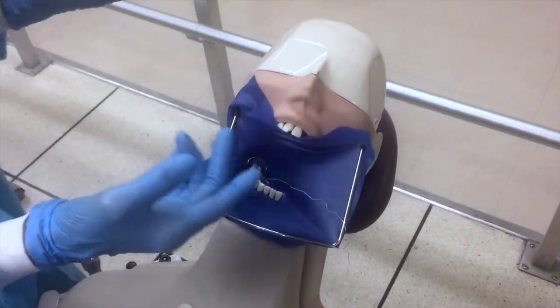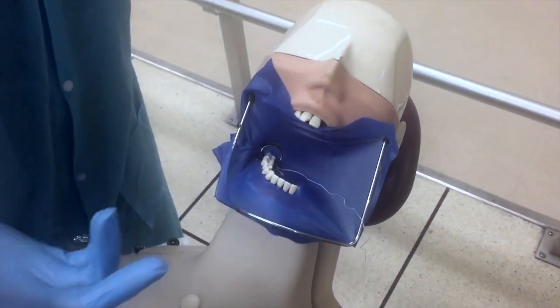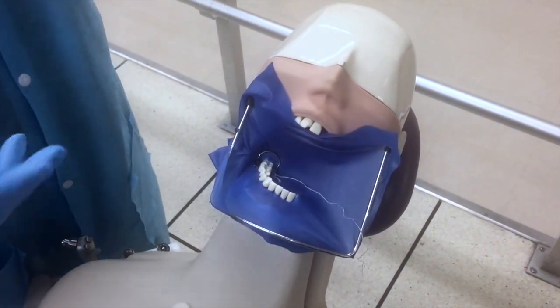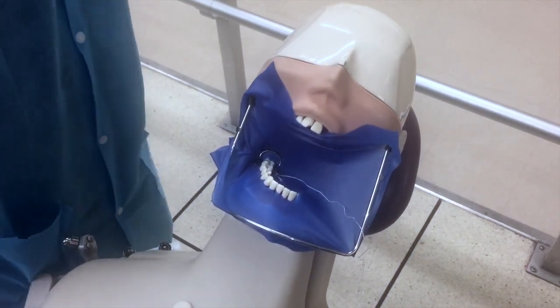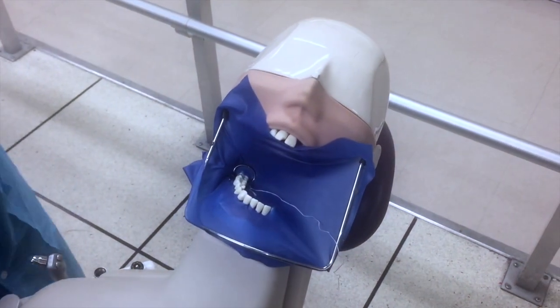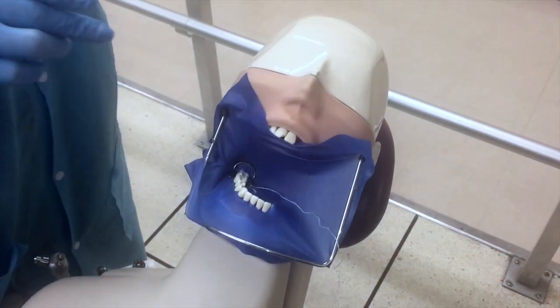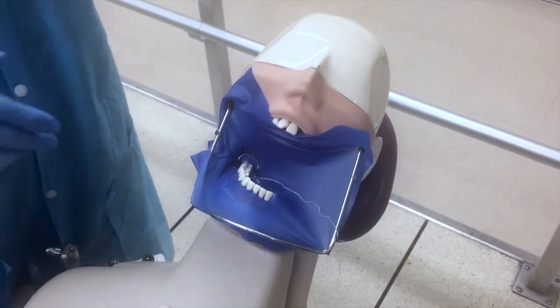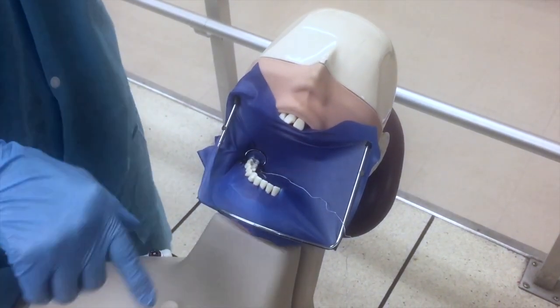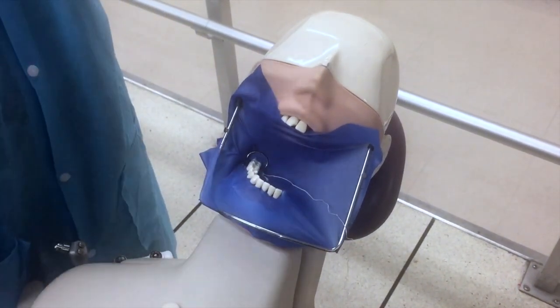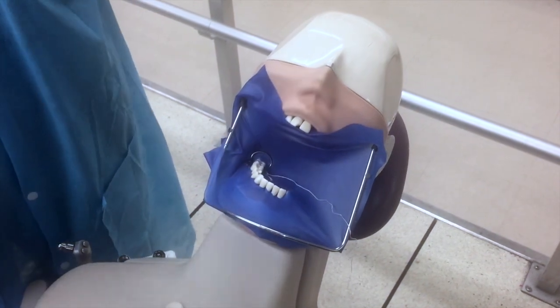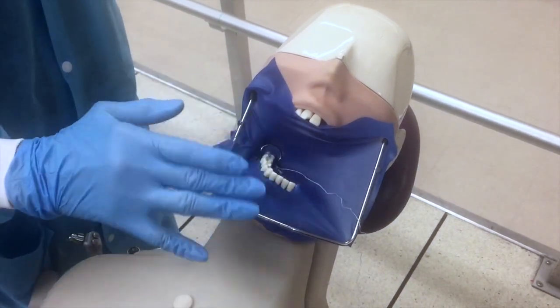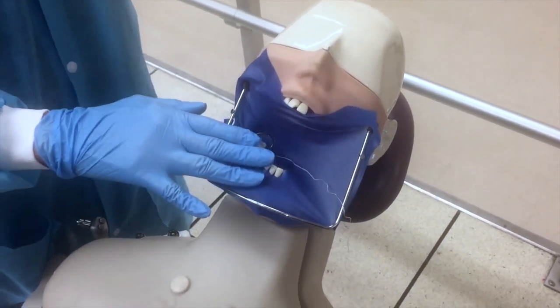Now we're ready. Well, we haven't cut our prep yet. You're not required to put the rubber dam on when you're doing a prep. But suppose you are doing a prep and it's getting really deep. You're thinking, am I going to have a pulp exposure? You're supposed to stop cutting and put the rubber dam on before you actually have a pulp exposure. That way we don't introduce bacteria.